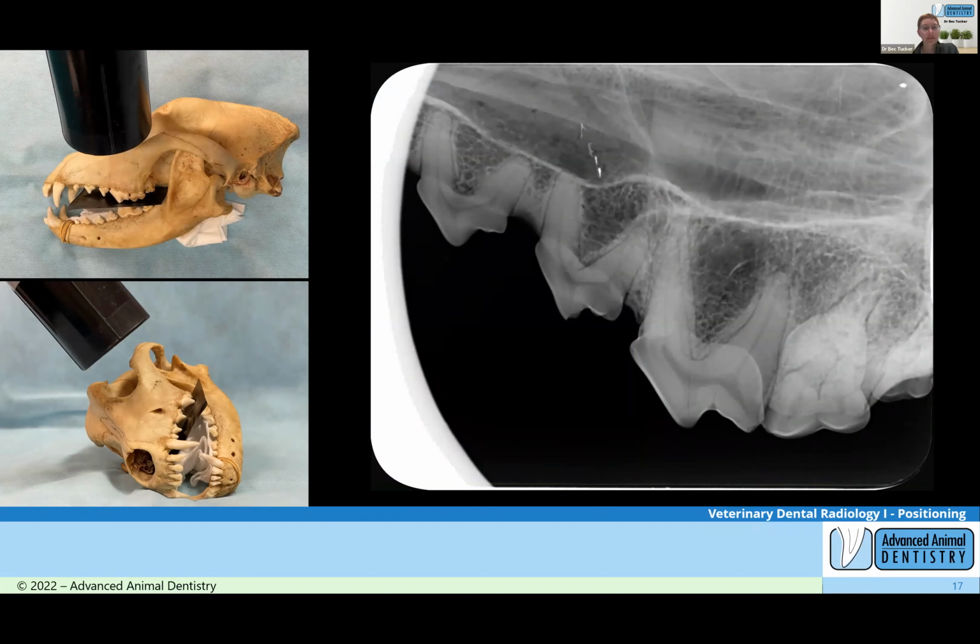One of the things we wanted to talk about is the way we take x-rays. It's possibly a little bit different from what a lot of vets have been shown, when people come into practice or we talk to vet students who have been out in practice and seen other people taking x-rays. I think a lot of us follow that chart that was produced, which basically has the patient in either ventral or dorsal recumbency. We don't tend to roll our patient to take the x-rays. We'll take the x-ray in the position that the patient's already in.